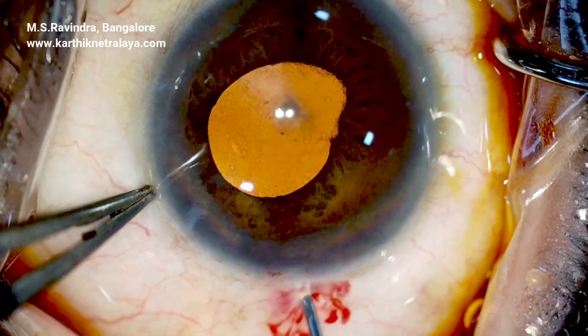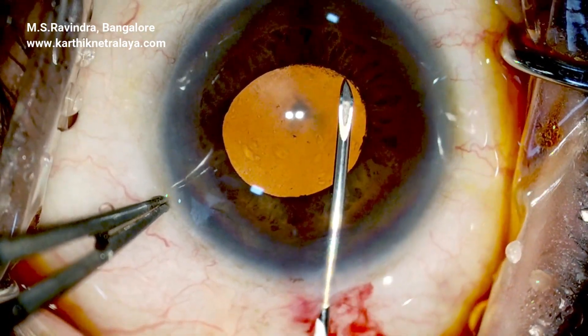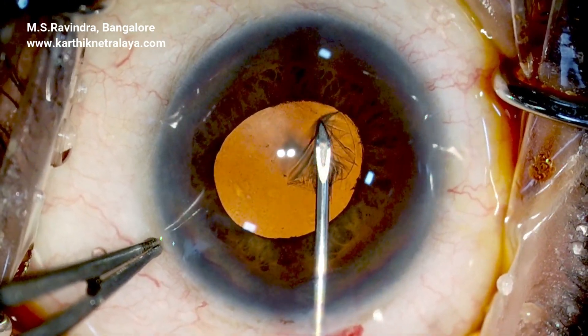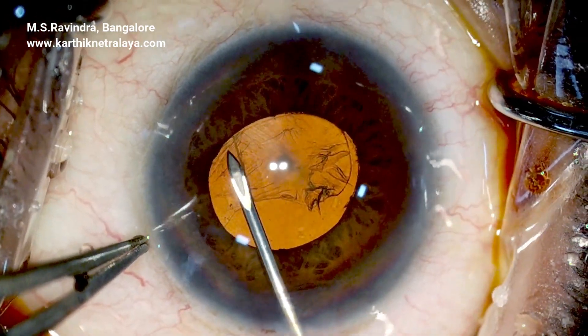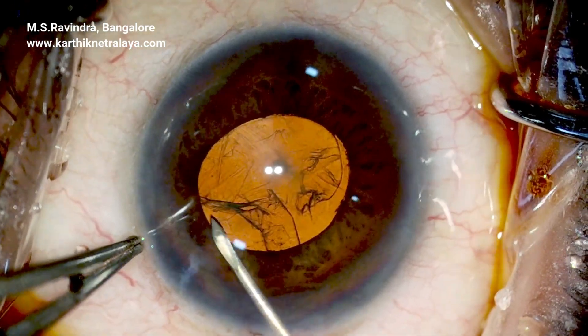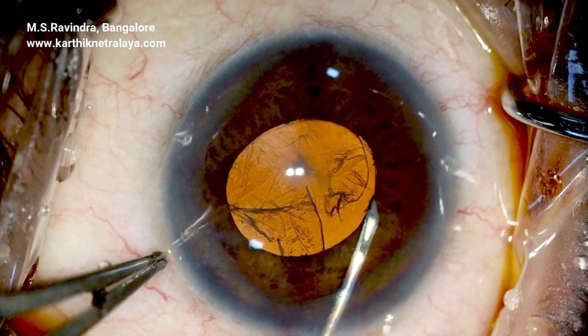A 2.8 mm keratome enters at the anterior sclera and travels across the limbus and peripheral cornea. The synechiae is released, rhexis is started, and it runs off after about 180 degrees.